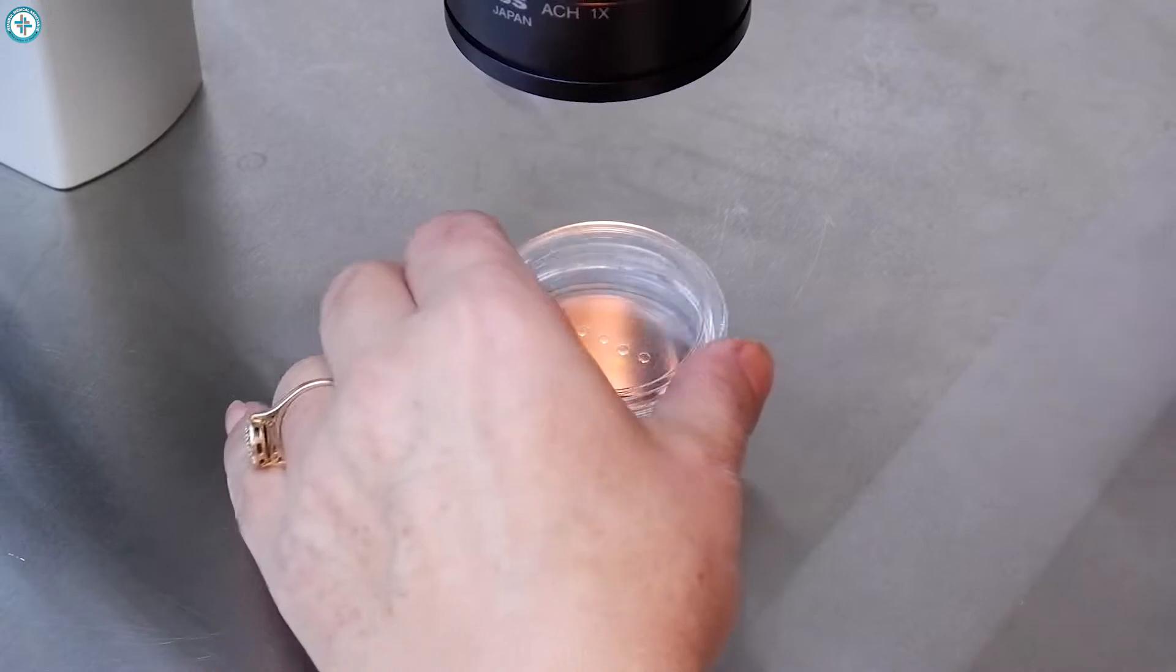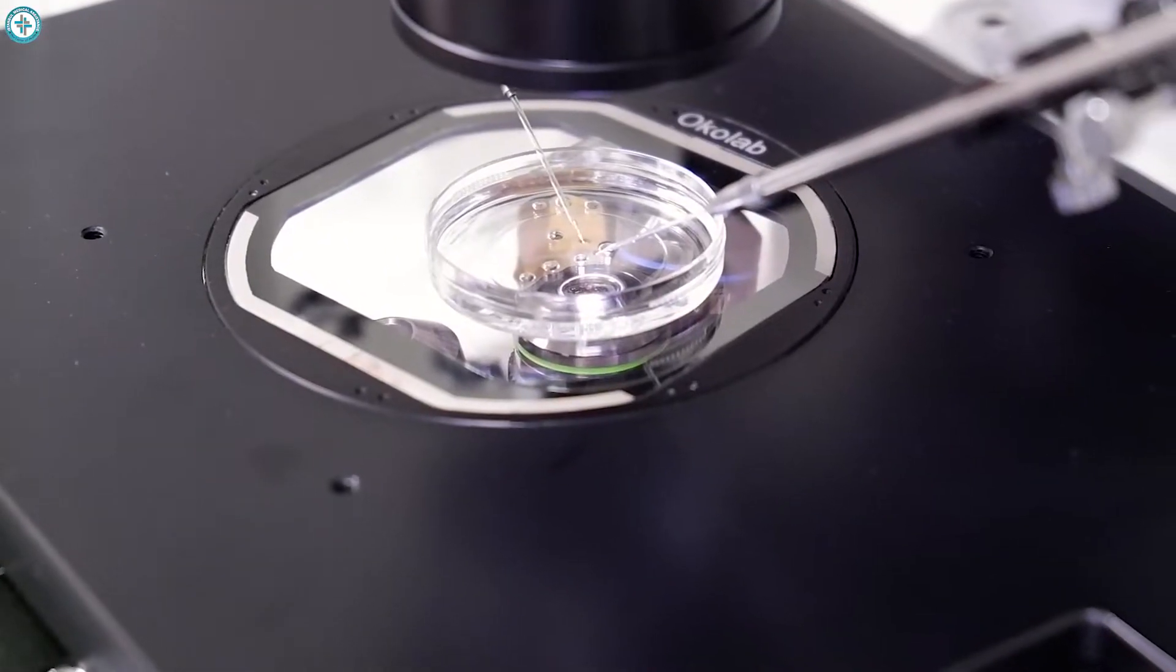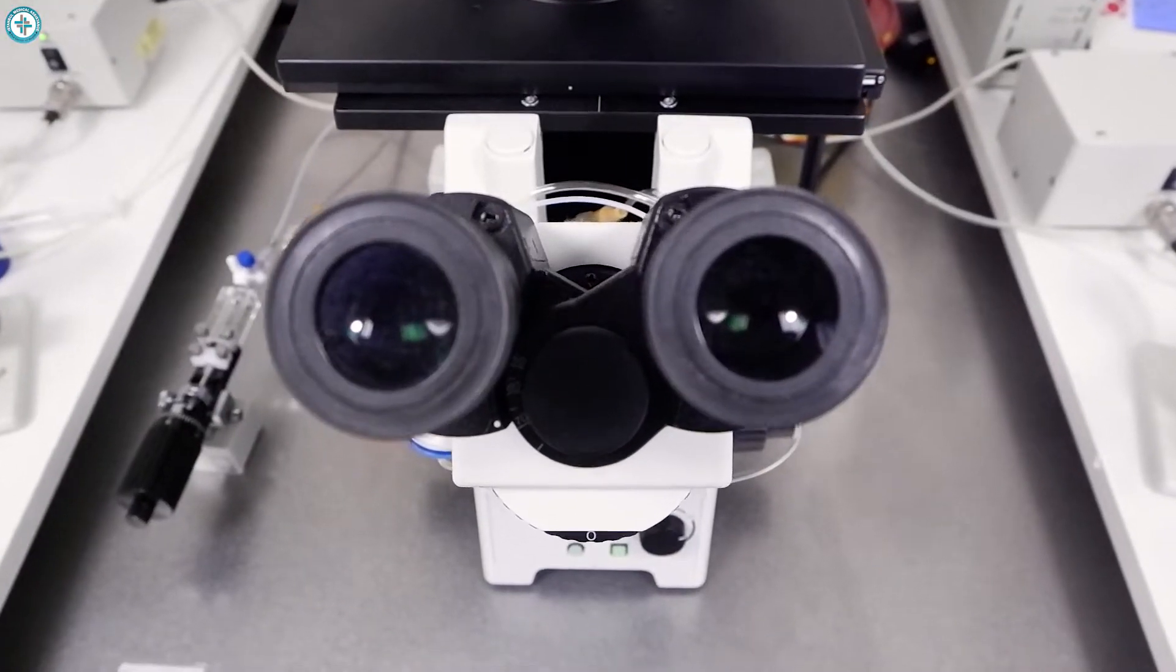Now it's time to prepare the sperm for the injection. She selects the good sperm and immobilizes them for injection by breaking their tail.